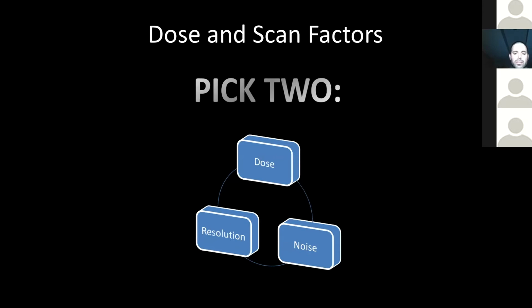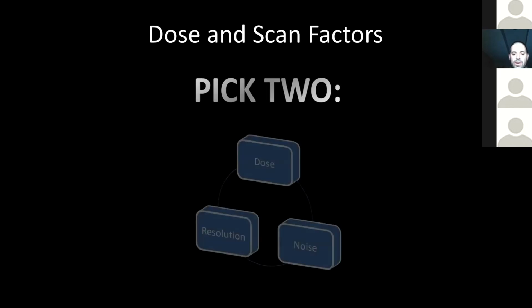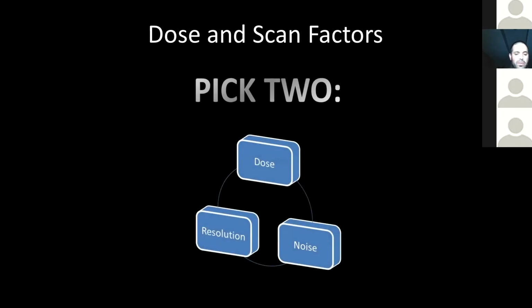I think about it a little more clinically, where if I'm plugging in the numbers for my machine and I have a young orthodontic patient that is a little more radiosensitive, which we'll discuss in a moment. And all I need to do is figure out where the teeth are, or where an impacted tooth is, or where the jaw structures are. I should be putting up with a noisier scan, with a quick scan time, and pushing a lower dose to that patient. I get the image quality and information I need from that low dose scan.